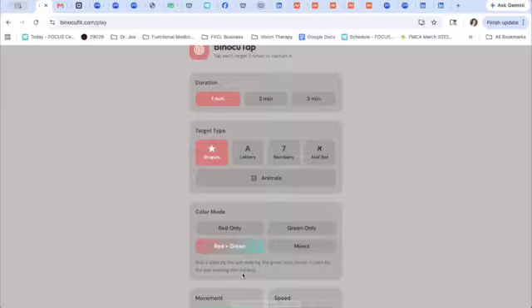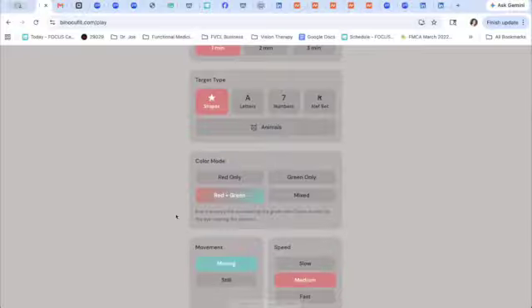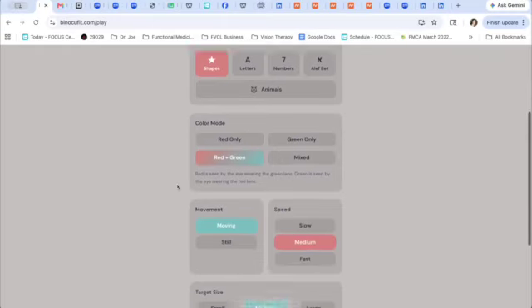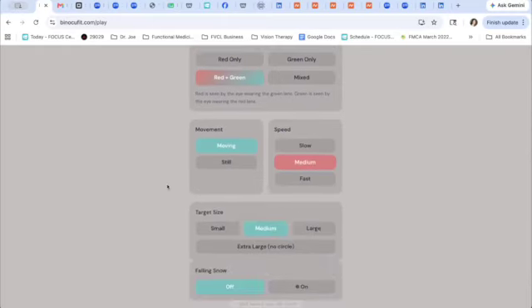So there is a little bit of training associated with a patient using this. It's not just simple like sit down and do what the app tells you to do. I do really feel like we want to empower people to be engaged in creating their experience, so they know how they're training themselves. Whether that's a parent or, I have a 6-year-old right now who's very able to manage setting things up so it's only seen by her amblyopic eye. And she sits and plays 10, 15 minutes of games on this a night, and she's doing great work.